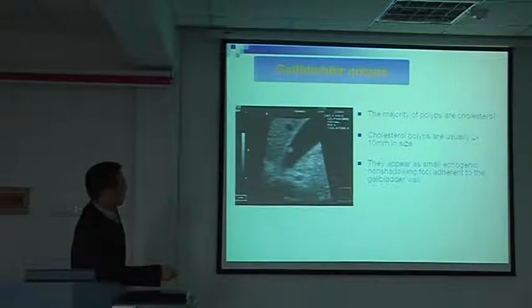Now, this is a polyp. If this is a stone, we have a posterior acoustic shadow.